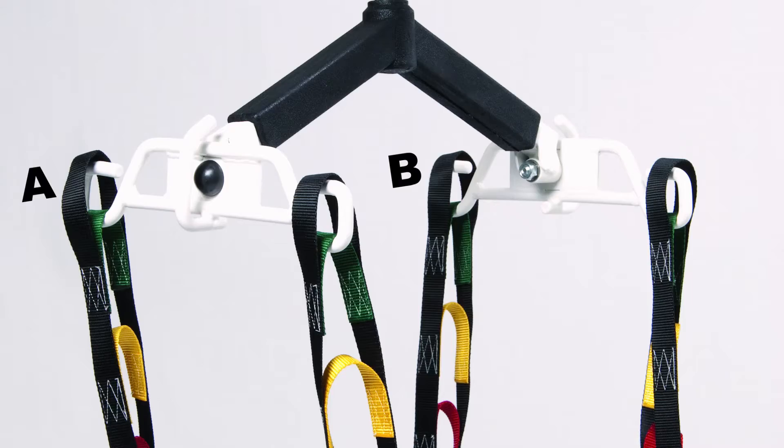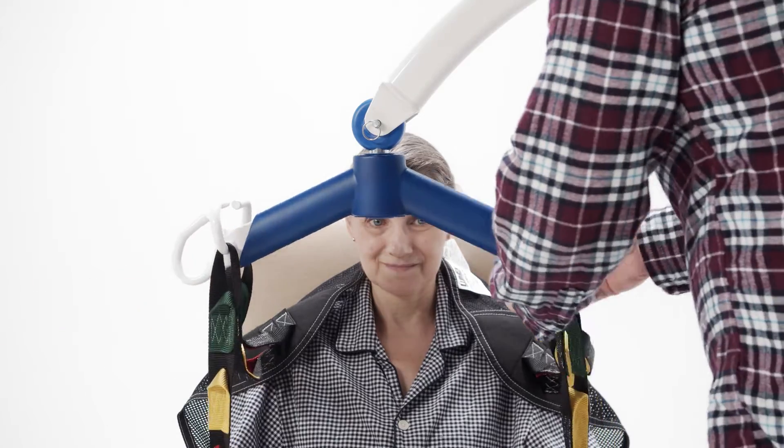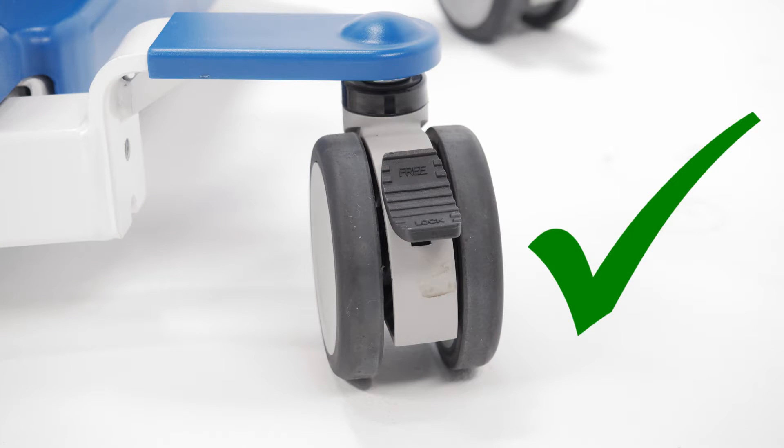Hook sling loops A and B to spreader bar A and B. Hook sling loops C and D to spreader bar C and D as shown in Figure 3 above. Do not lock caster brakes in order to allow the lift to properly balance weight.